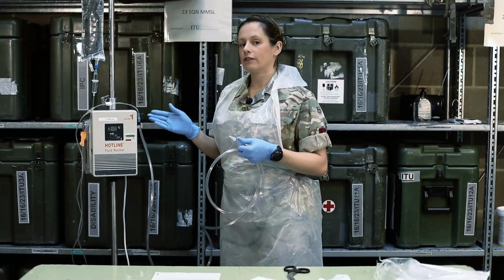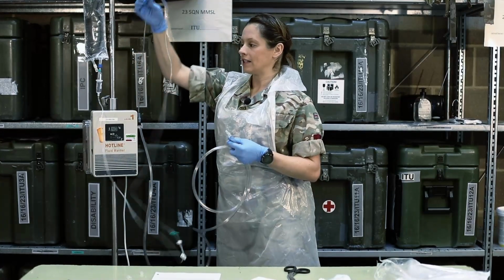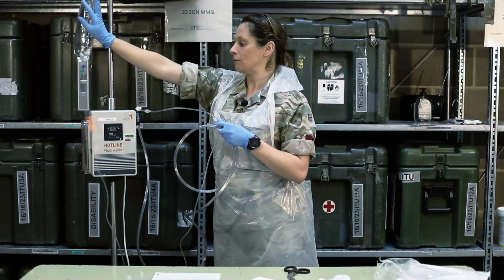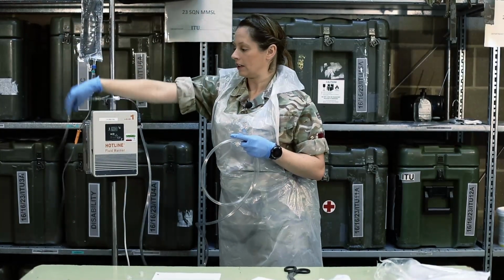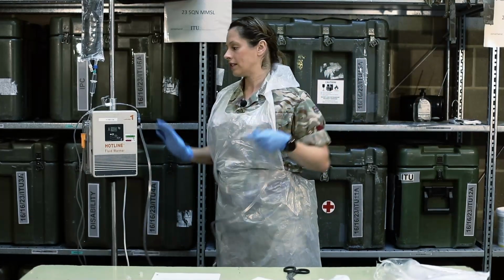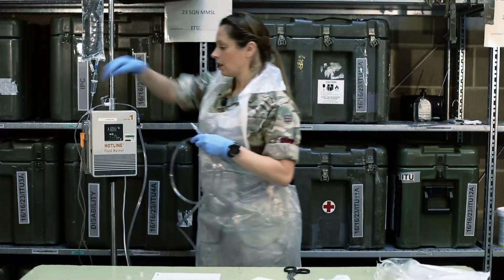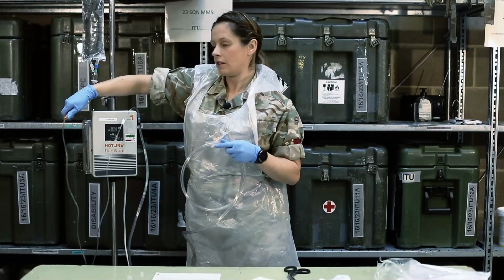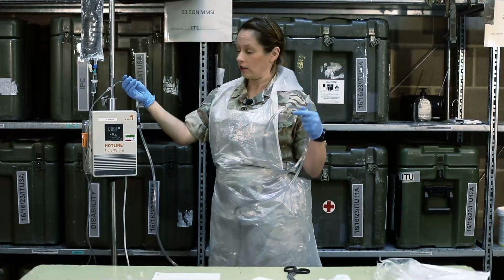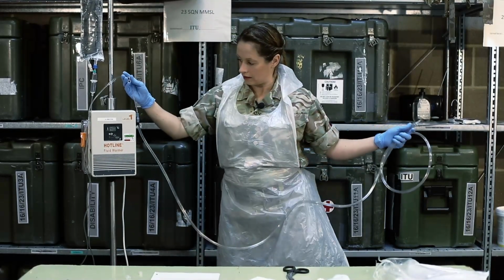Now I've primed my fluid giving set with the fluid that I want to use with my patient, and I've attached it to the Hotline giving set. Just to avoid confusion, I like to keep my fluids on this side, along with the fluid giving set on that side, and my Hotline giving set, which is going to end up with the patient, on this side. To then prime the line for the Hotline giving set, I'm just going to unclamp the fluid giving set, and then also unclamp my Hotline giving set. And that's running through nicely.